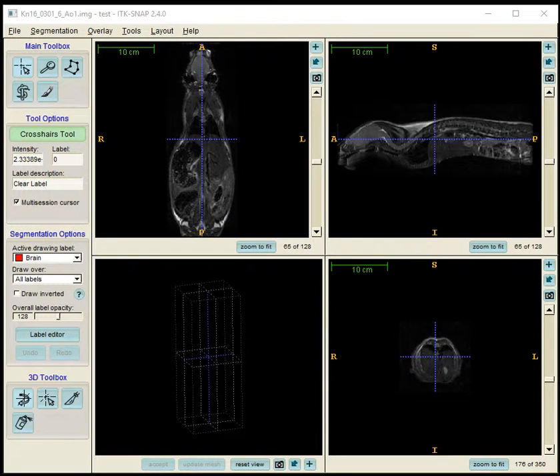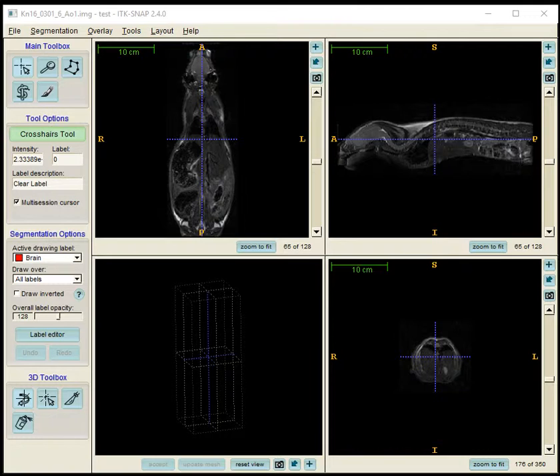This is how to segment organs from a whole body mouse MRI dataset. We'll be segmenting the brain, liver, lungs, both kidneys, and the spinal cord. For now I'll just show the brain, and that'll provide the basic steps to do the other organs.